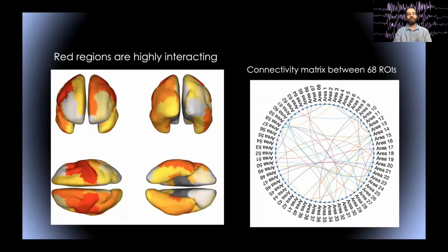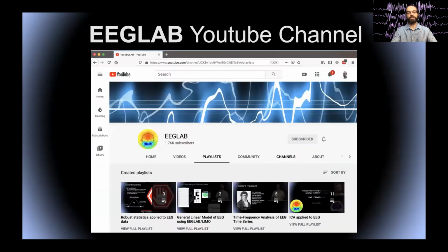different approaches. SIFT does partial directed coherence, so it considers all the areas at once, and also it does indirect connections. This is just pairwise connection, so there can be spurious connections. And here you can use it with lots of brain areas. In SIFT, you're really limited to 9, because computationally and in terms of the data that's usually available, you're usually limited to doing 9 areas at most at the same time. So these are active areas of research.